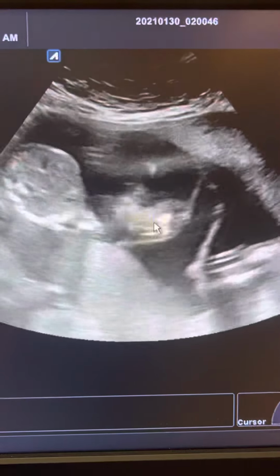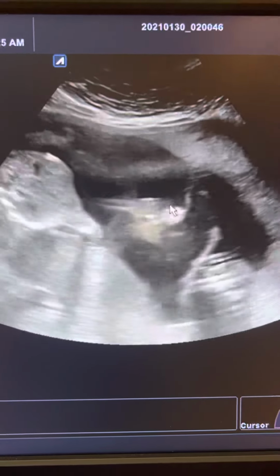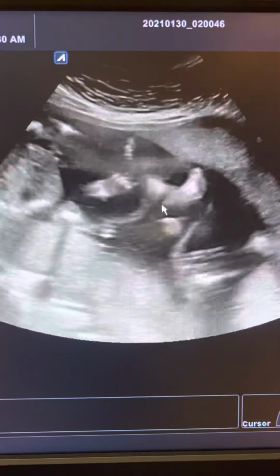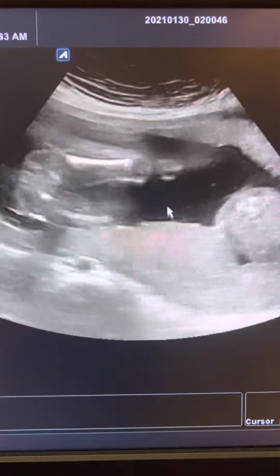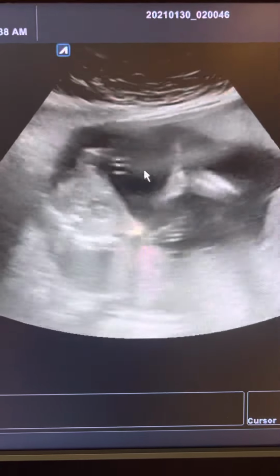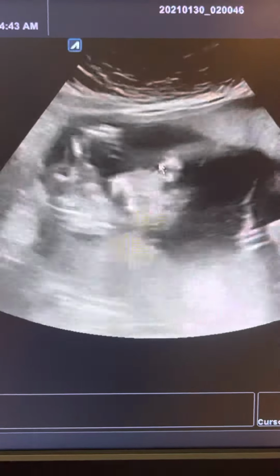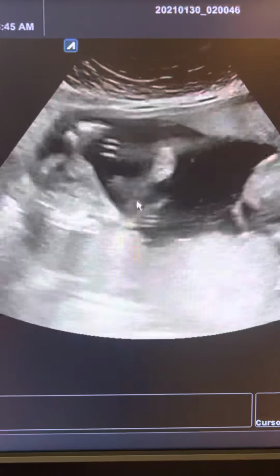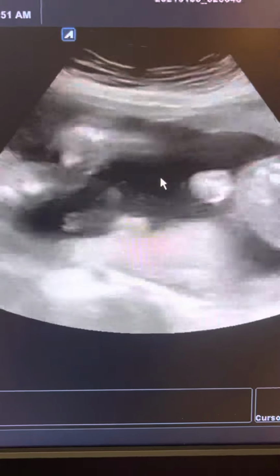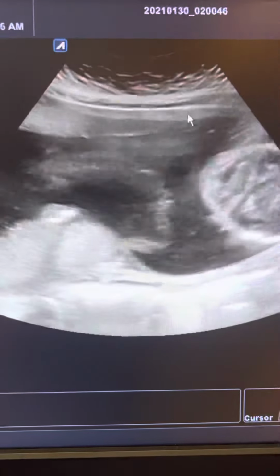We can see every limb of the fetus. For example, here is the hand of the upper fetus. It comes near this membrane, but it cannot pass to the sac of the middle fetus. It means that each fetus has its own gestational sac without any interference with the other fetus. So the fetuses are 3 chorionic, 3 amniotic.